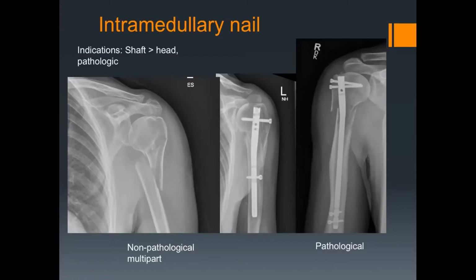They were locking plates for the elderly. I think all that happens is you get fixation distally, where the bone is better, and then that head just moves around the raft of screws. It was one of the things, another paper from Ralph Hurtle, where he says it's not a good environment for healing. And I think a lot of the time when it's reported as being healed, actually the fractures aren't fully healed. I think they take a long time to heal.